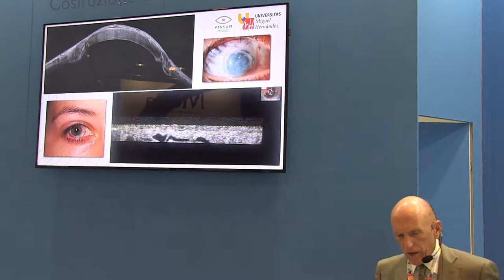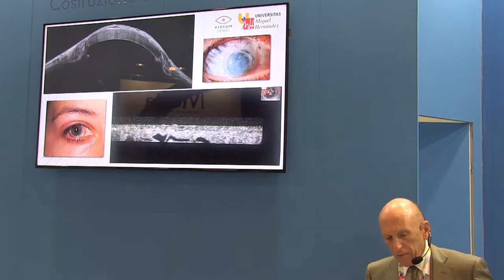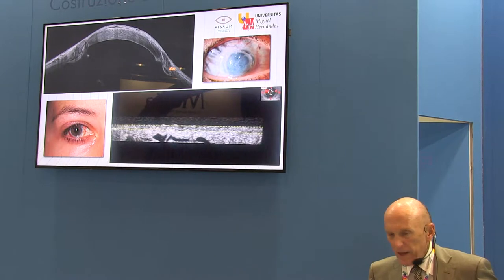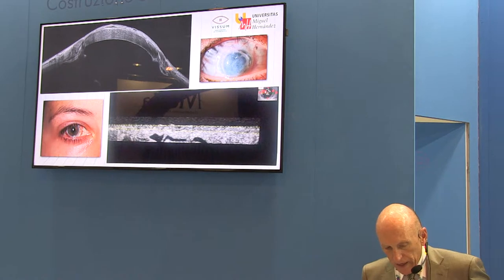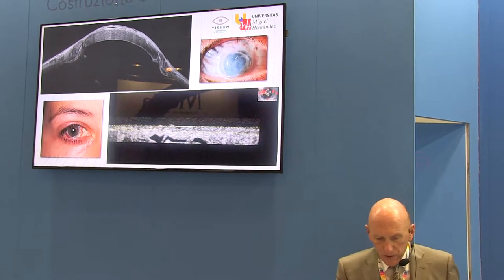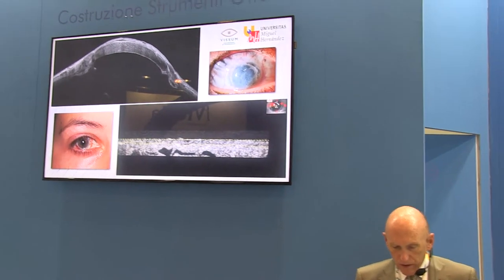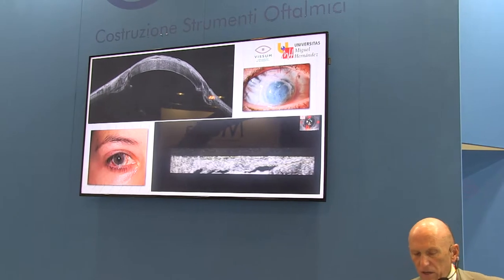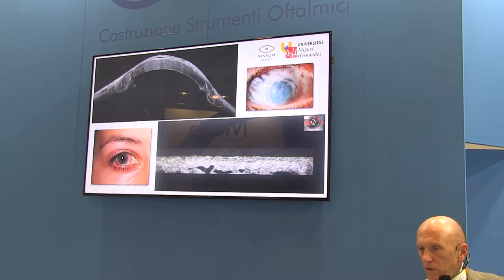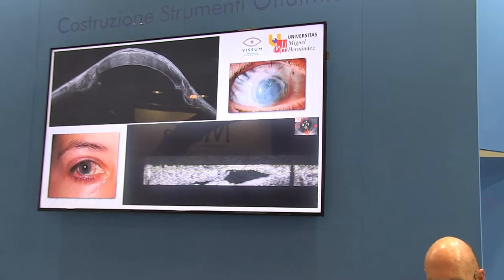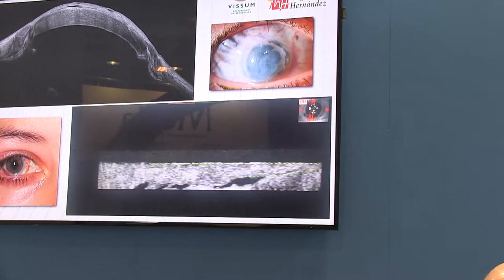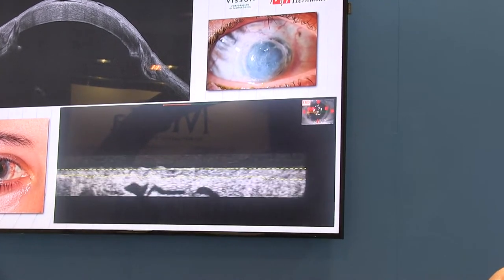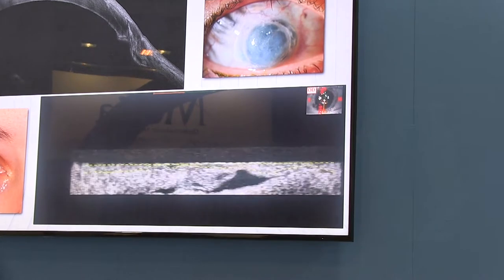This is the aspect of the cornea. Look here — we have epithelium hyperplasia. This epithelium hyperplasia is very well observed here. We have the cornea, and in this video we can see that we have intrastromal vacuoles. So far I knew that we had, obviously, a bullous keratopathy, but this is intrastromal vacuolization of the stroma.